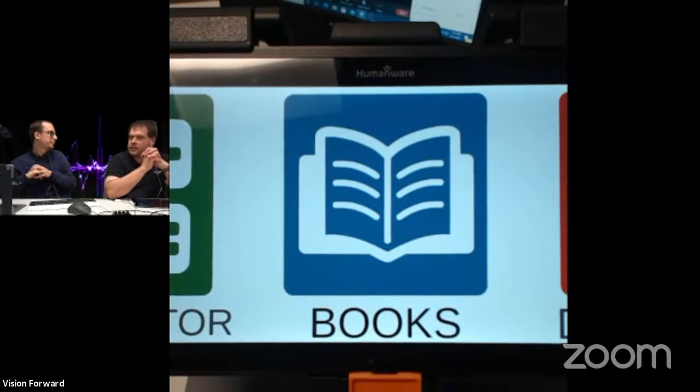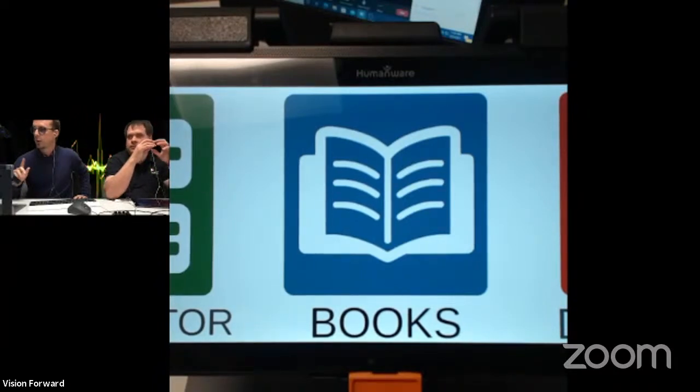Is there any 6-inch though? I think Zoomax have a 6-inch, but I've never tried it. So does it have OCR? I think yes. There's another company I think that's got one too. I can't think of it off the top of my head. If anybody else knows any more, then let us know. But yes, we've had success with the Compact 10 and the Snow 12 for OCR for sure. Oh, somebody says there's a Compact 6 as well with OCR and speech. So thank you very much.